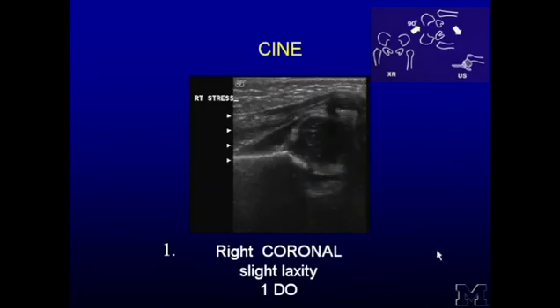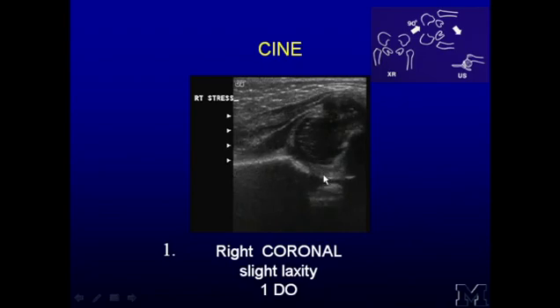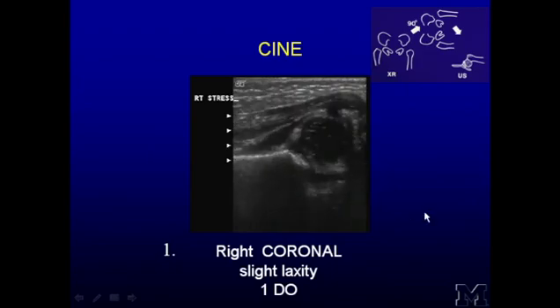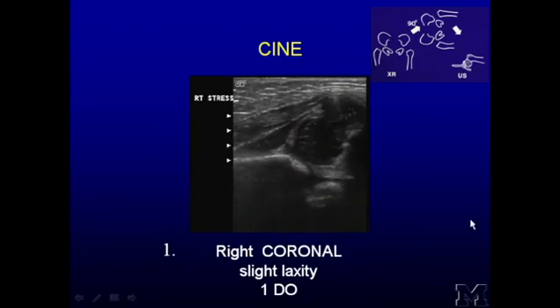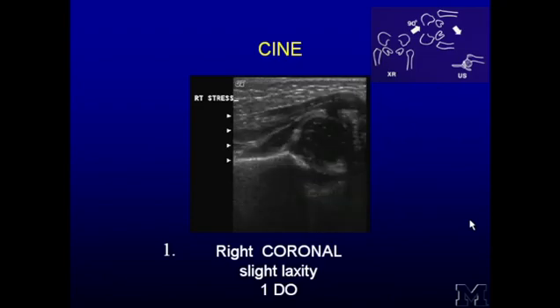Now in this one, there's a little bit of laxity. We're still coronal. And you can see how this distance here is increasing, and as I'm pushing on the hip, it's slipping a little bit laterally. It's not excessive, but there is a little bit of laxity here. Sometimes if the child is really just a few weeks of age, this could fall into the realm of physiological laxity, but you have to follow it. It could be still under the influence of the maternal hormones, which makes the hips a bit loose.